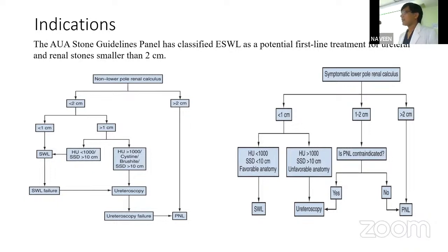Because first there are sulfide bonds, within them disulfide bonds, and in disulfide there is sharing of p orbitals, with much more overlapping. And brushite stone is recalcitrant because it has less of hydroxyl bonds. The more water there is in something, the more it will tend to fragment. That is why the hydroxyl component of brushite is less, and oxalate also has less of hydroxyl groups. So that is why they are recalcitrant.